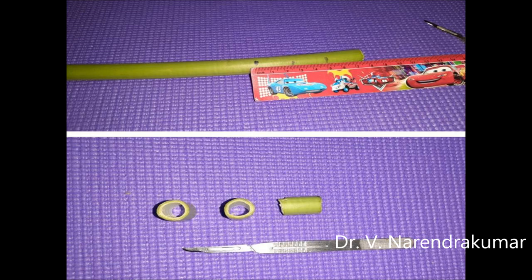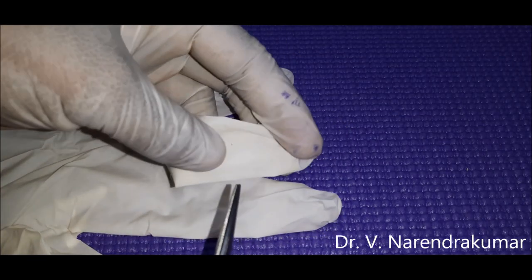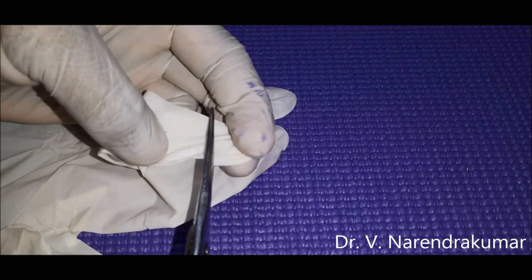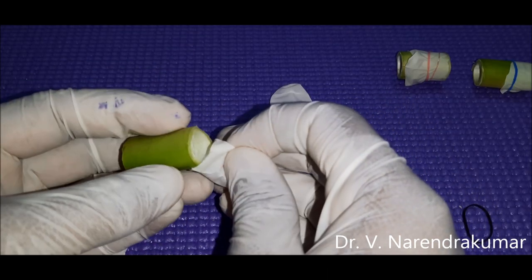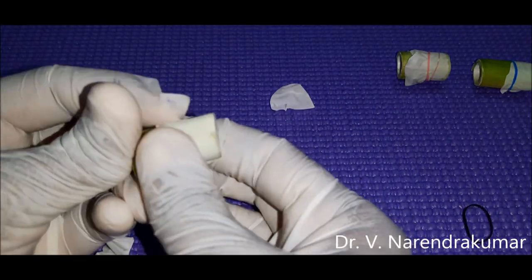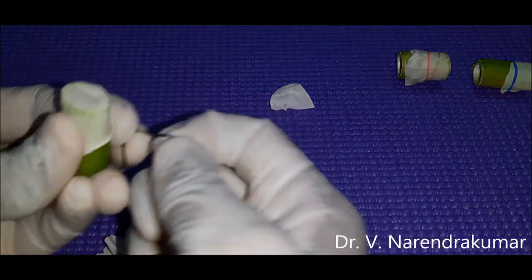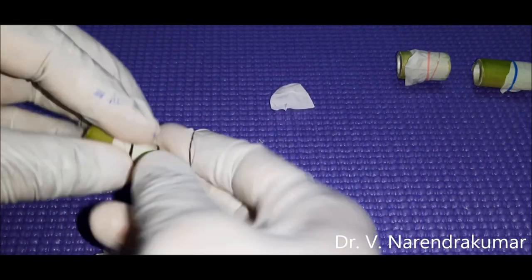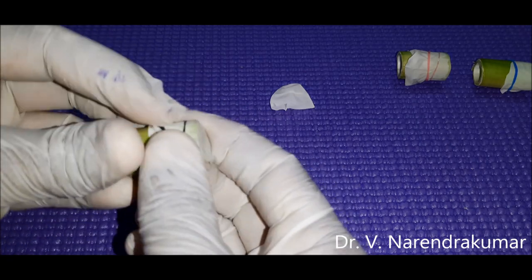Next, take a surgical glove — we need the fingertip area. So just cut the fingertip area, and with that you encircle the pieces. Make the surgical glove layer slightly tensed by fixing it using a rubber band.